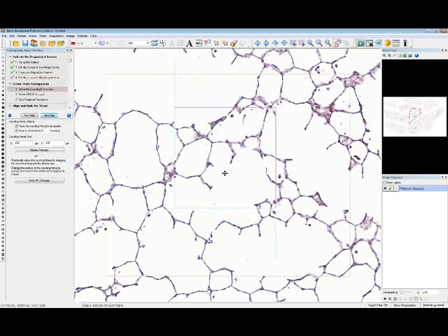At this point, I can set up our counting frame. I know it's a little bit hard to see for you in this step perhaps, but you'll be able to see it easily in the future steps. We can manually set up the size. As Dan was mentioning, this is the dissector, and the point of using the dissector is we want to count objects once and only once, despite whether we're counting bridges, connections, cell particles, anything we're doing.